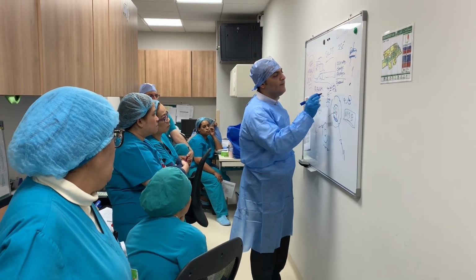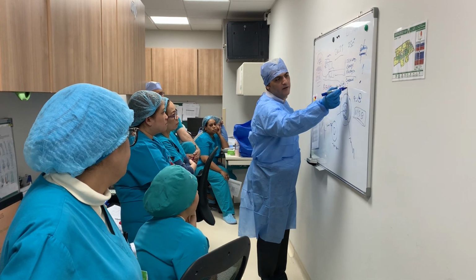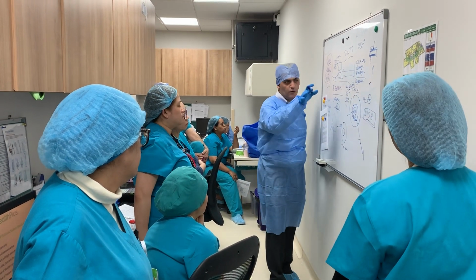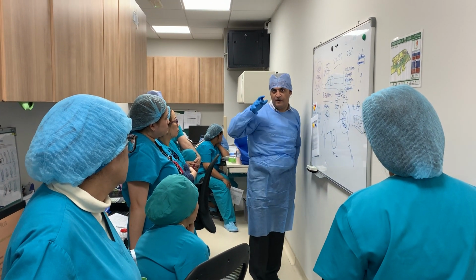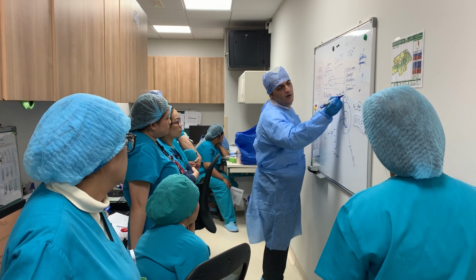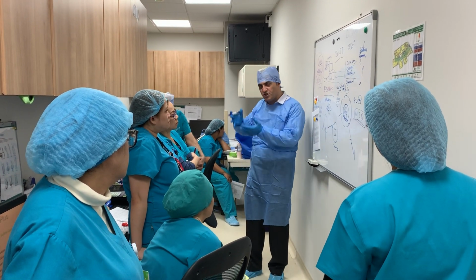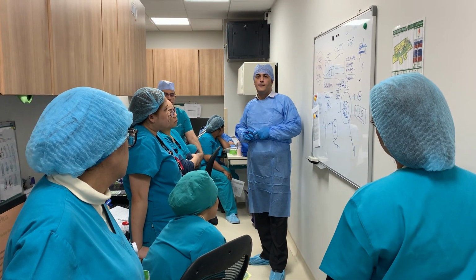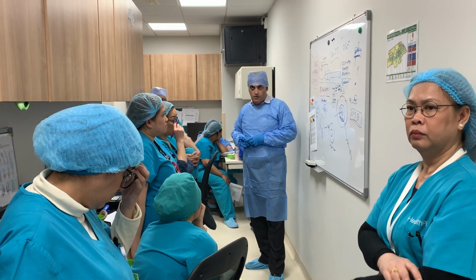By the way, 50 microliters is more than enough for 10 million. So even if you have 10 million with you, it would still be enough. But to make sure of the highest efficiency, we say 5 million. We don't say much more than that. Any other questions? Any very specific recommendation for the reagent itself?